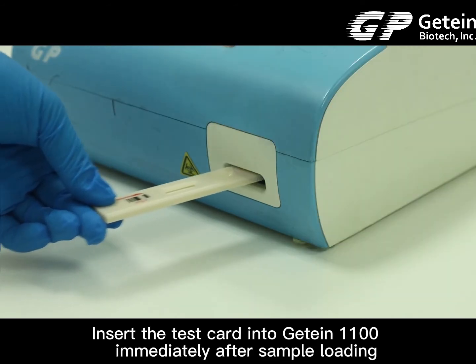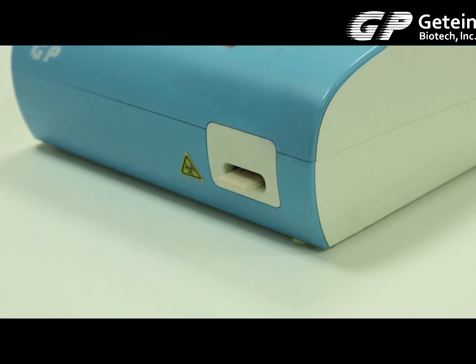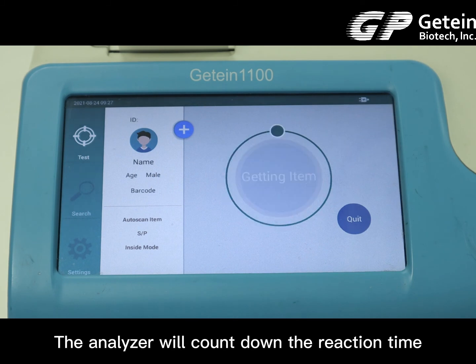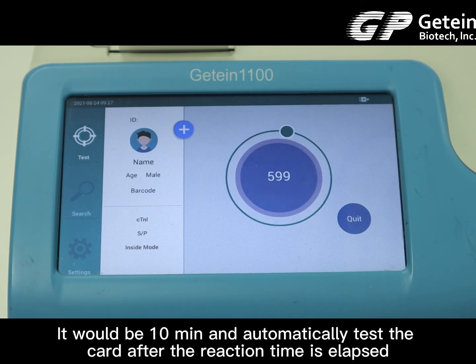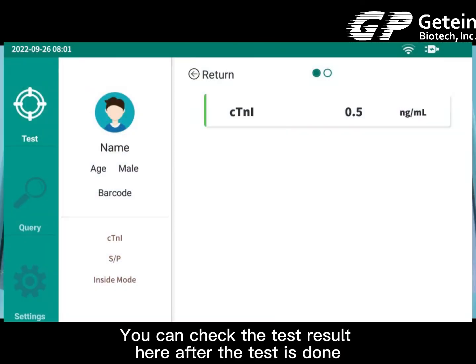Insert the test card into Getein 1100 immediately after sample loading. The analyzer will count down the reaction time — it will be 10 minutes — and automatically test the card after the reaction time has elapsed. You can check the test results here after the test is done.